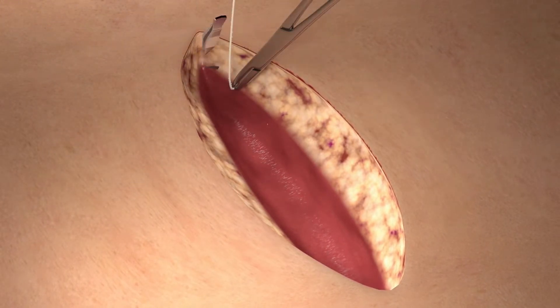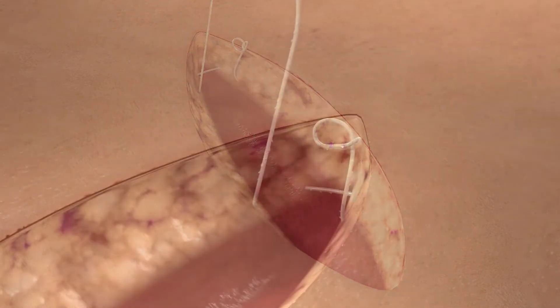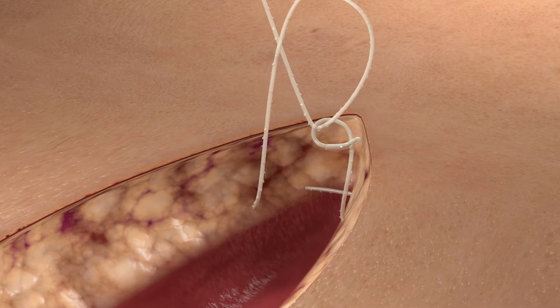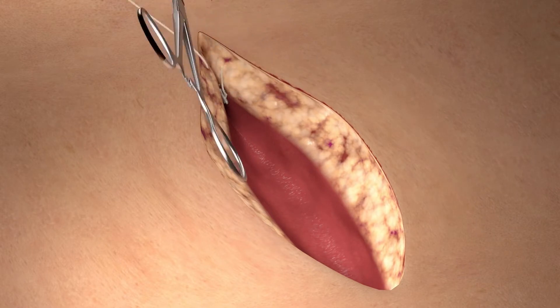We begin by taking a bite of the designated anchoring tissue medial to the apex of the excision. Pass the needle through the variable loop and pull in order to tighten the loop and create the fixation point. Then we take at least two loose bites of the tissue to be approximated in a simple continuous fashion.